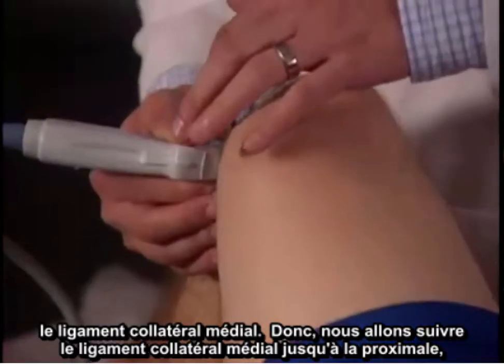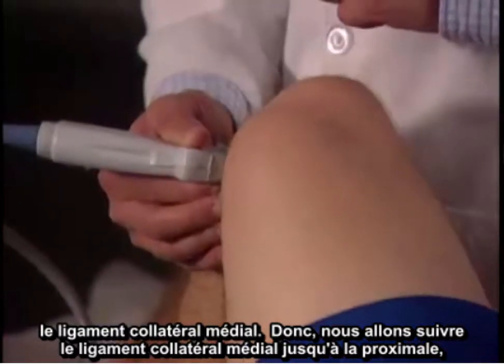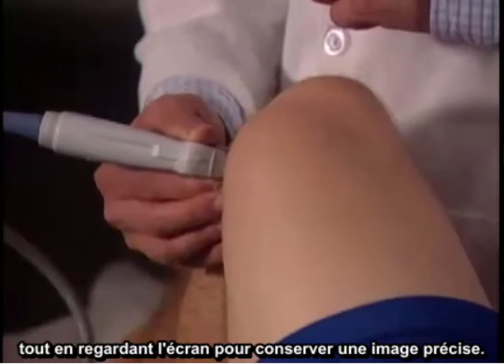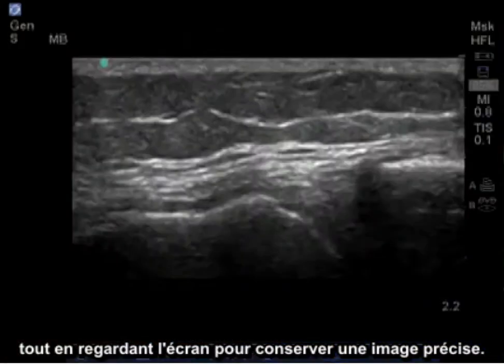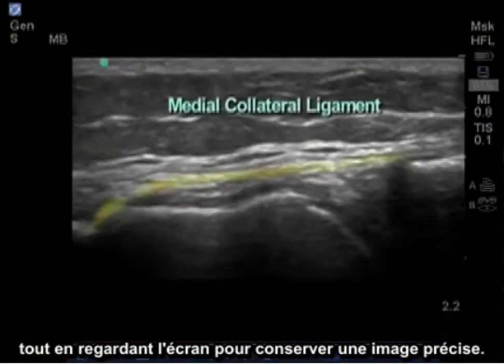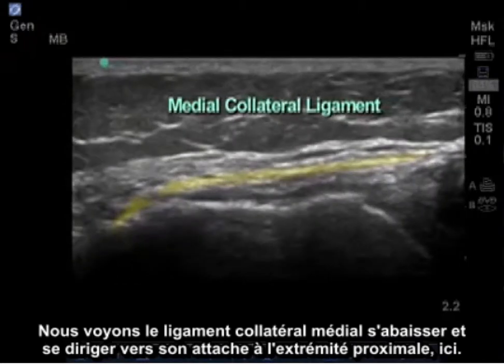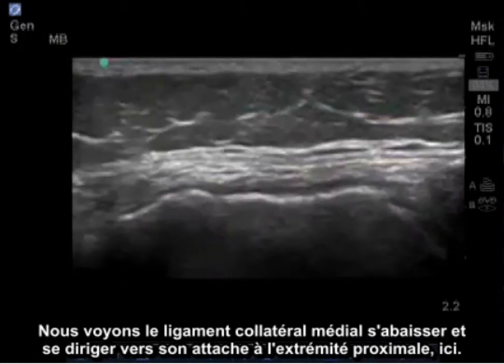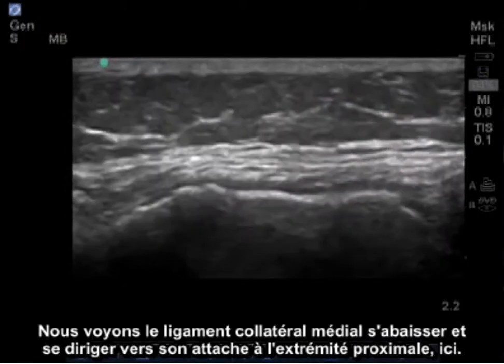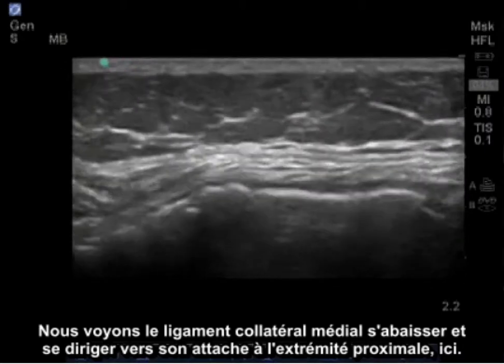So we're going to travel along the medial collateral ligament while looking at the screen to maintain an accurate image. We see the medial collateral ligament bending down and heading towards the attachment at its proximal end.